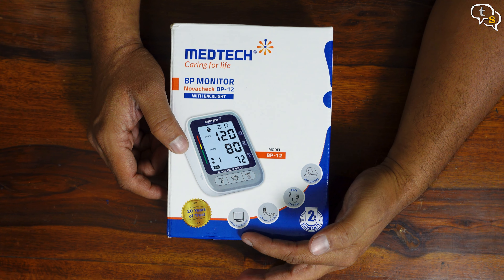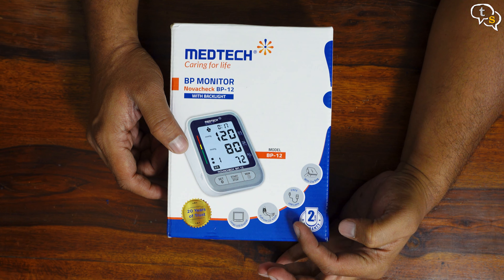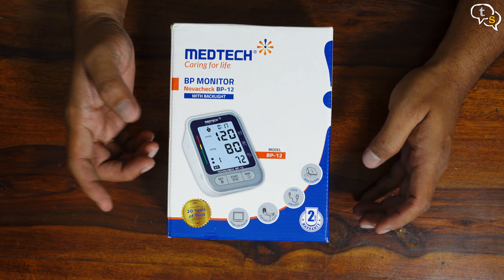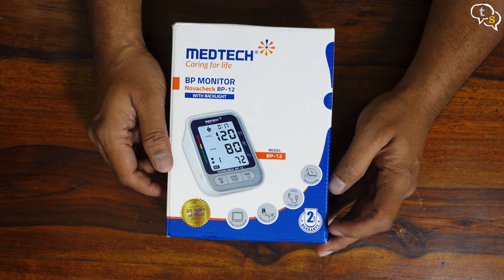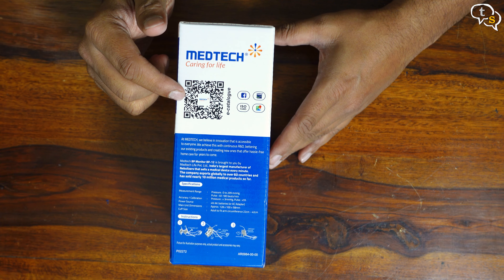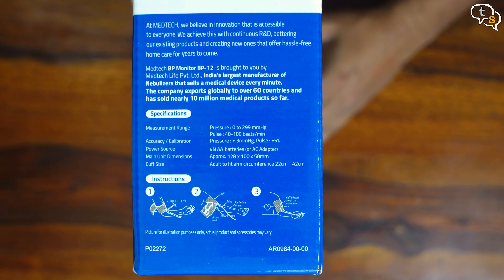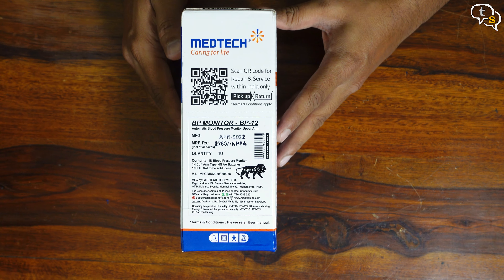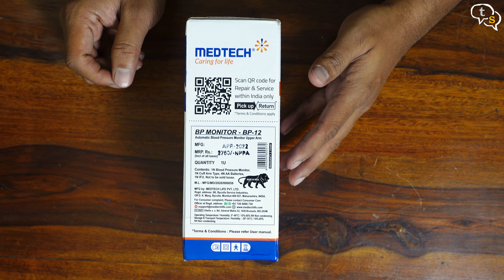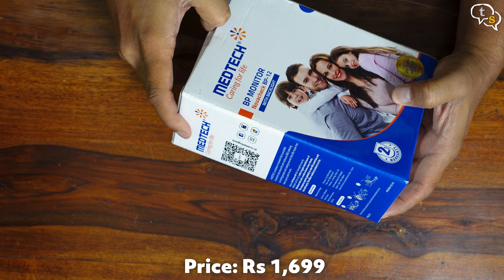The LCD screen looks quite big, cuff size can fit between 22 to 42cm, a USB-C cable is present and a zip bag is also included. 2 years warranty — that's what most users will like. A QR code is available on the side linking to Medtech's e-catalogue, with specifications listed below, and here's a QR code for repair and service calls. Price is marked at Rs.2760 but it's actually available at Rs.1699 on Amazon.